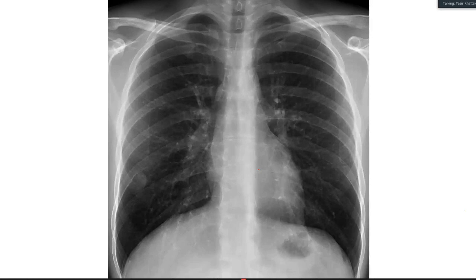When we do a pleural tap, we always say avoid the lower margin of the rib. Yes, sir. Neurovascular bundle, sir. So there is a neurovascular bundle there. So either there is an artery or there is a nerve. So there are only two things there. Either this is an aneurysm from an artery, or this is a nerve origin lesion.